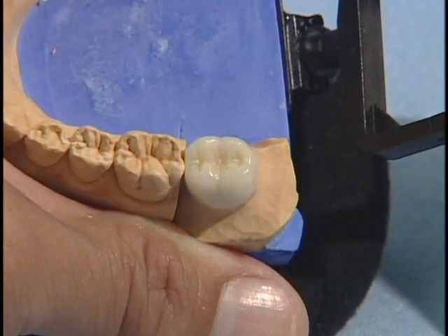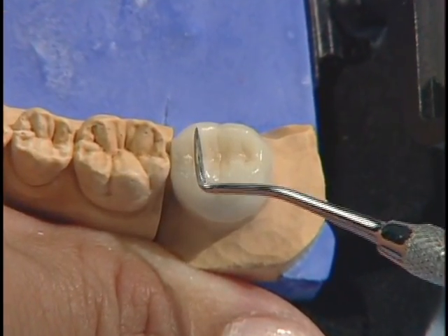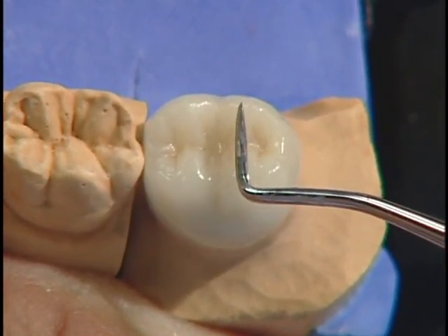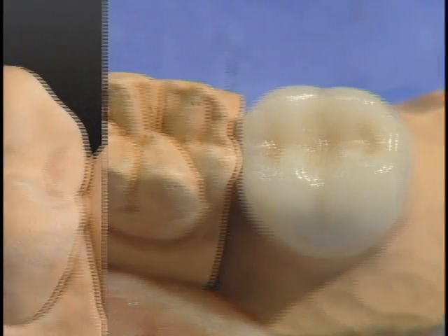What I don't want to see are triangular ridges on molars that are set directly across from each other, with the supplemental grooves at 90 degrees. These tend to look like railroad tracks on the occlusal surface. As you can see, they just don't look right.